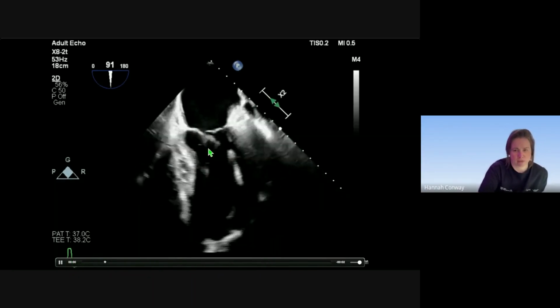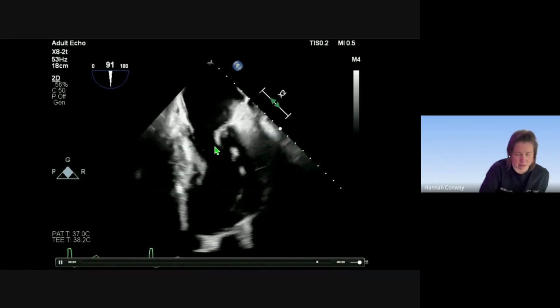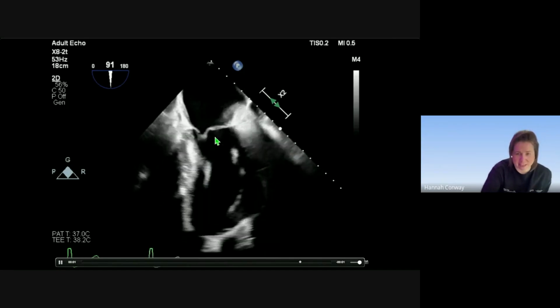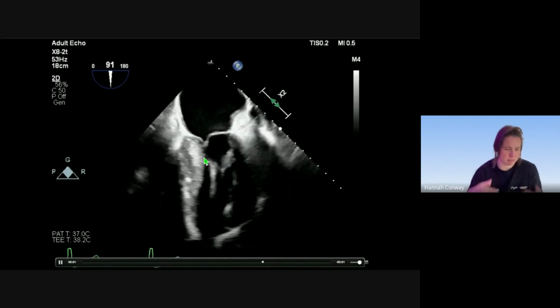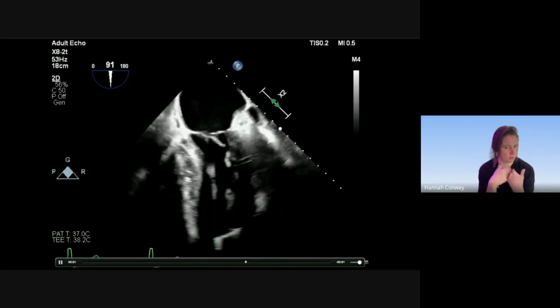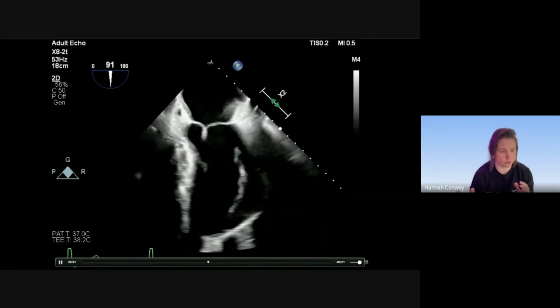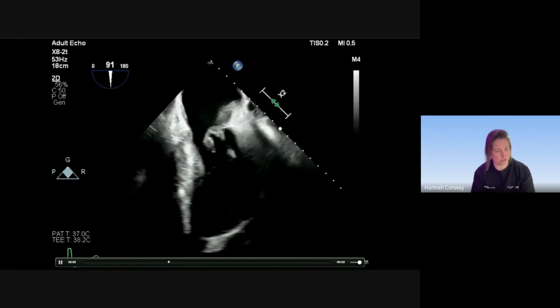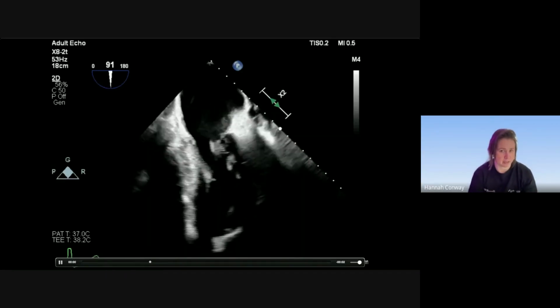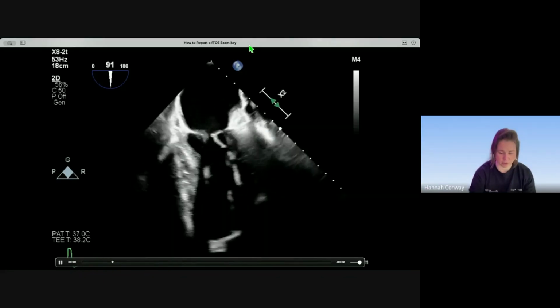And in this instance, the actual mitral valve anterior leaflet is slightly longer than I would expect. The coaptation is not normal from what I can see. You don't have to do fancy measurements. That's for someone else to do. But at this level, you can describe grossly and descriptively what you think might be wrong with the appearance of that. And I think that would be sufficient.